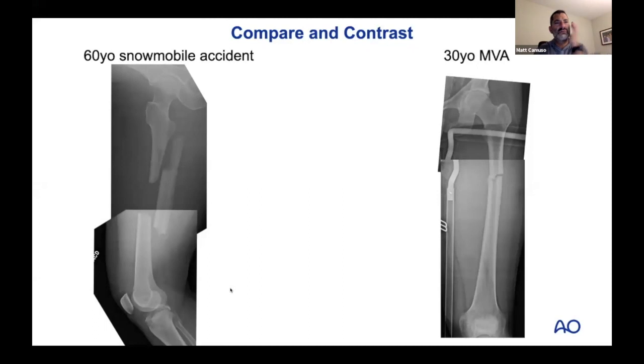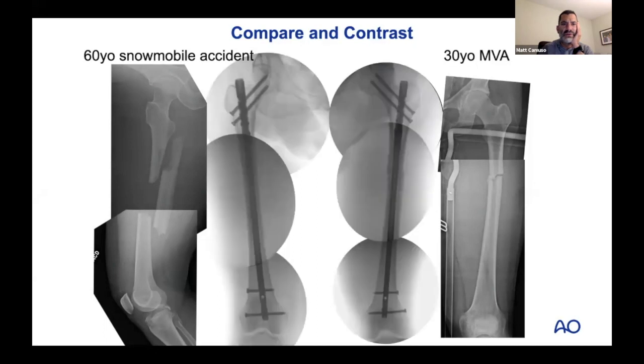All right. So right side hard, left side, or I guess left side hard, right side easy, right? So this is what it looks like when we're through. And so which side is malrotated? It sure looks like, if any, the right side looks bang on, and the left side doesn't, right?